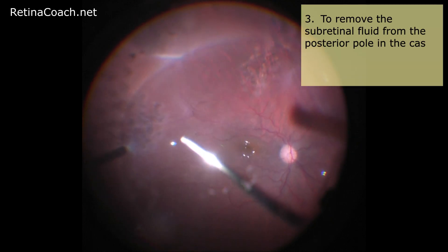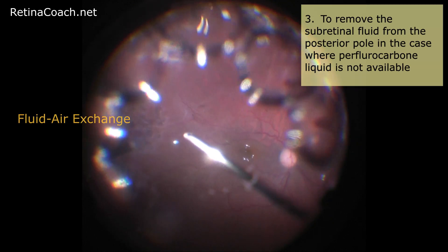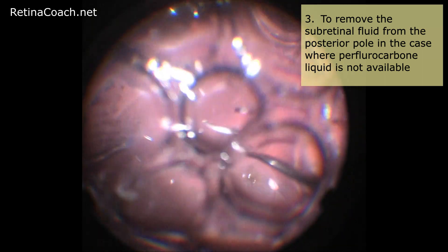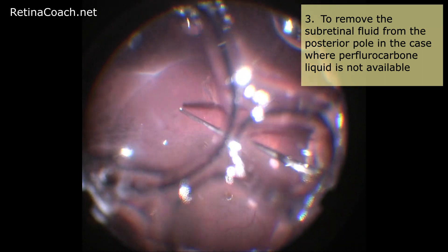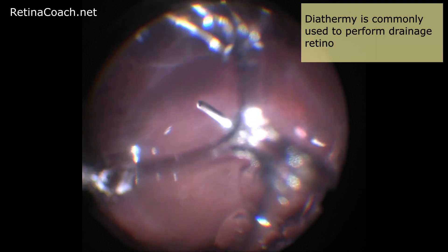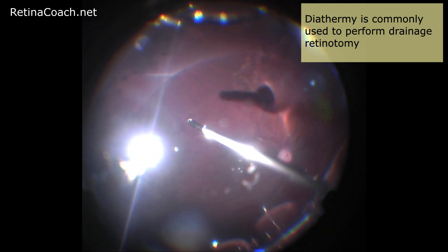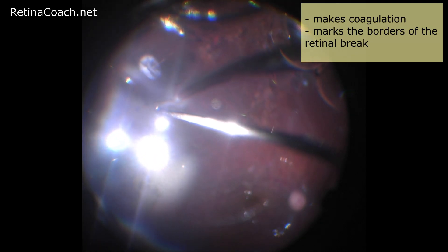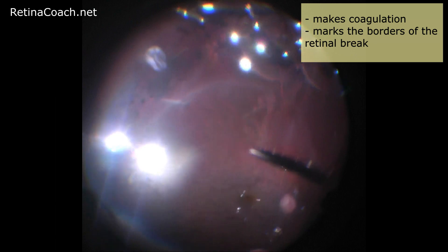Also, drainage retinotomy can be used to remove the subretinal fluid from the posterior pole in cases where perfluorocarbon liquid is not available or for some reason planned not to be used. Diathermy is commonly used to perform drainage retinotomy. The benefits of diathermy are that it makes coagulation, so it prevents bleeding and also marks the borders of the retinal break.